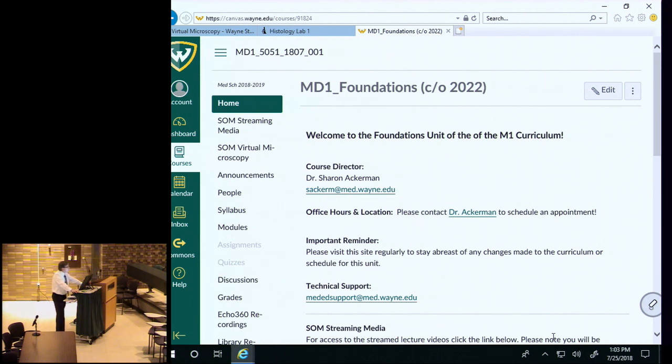Hello, I'm Rod Braun. I'm the discipline director for the histology subject and embryology as well, but what I want to talk about today is histology CBLs or laboratories, and I'm going to give a quick tutorial on how to use our virtual microscopy software web-scope.